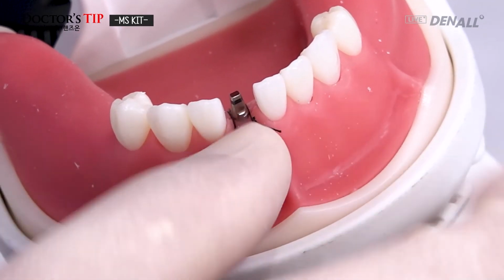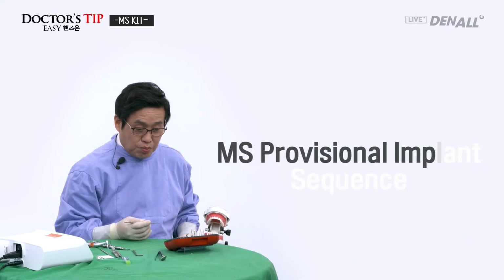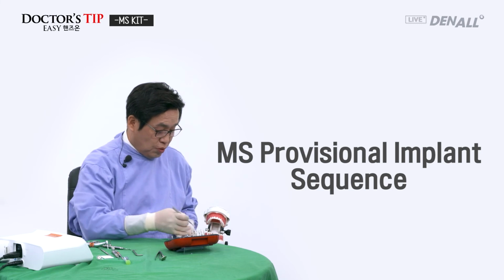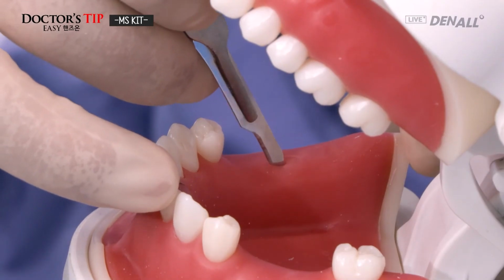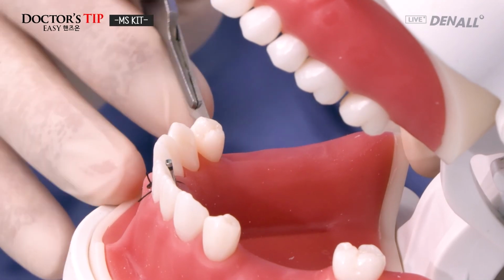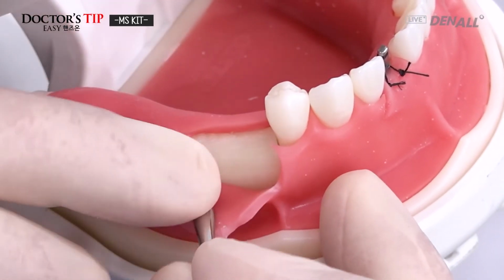Like this. An MS implant is placed, and now you can create a provisional restoration. Next, let's see the provisional implant sequence, and I'll show you how it can be bent. So I'll put one in the molar area, crestal incision, and then the flap is elevated.